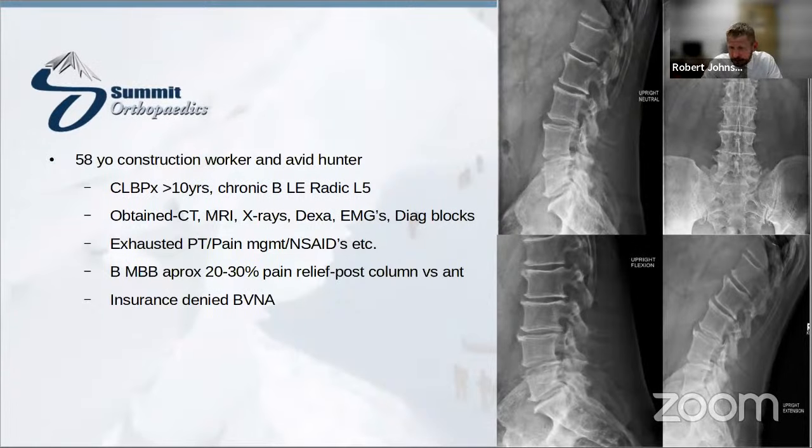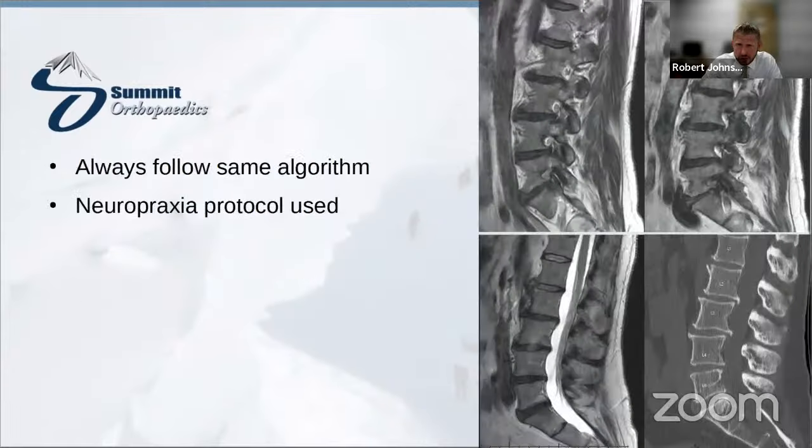As you can see from the x-rays, he's got listhesis at multiple levels, most of it's static, very little dynamic. He's got osteophytes, degenerative disc disease, disc collapse, multiple levels. But this gentleman was just absolutely adamant that he would not fuse. He didn't care what it cost, what he needed to do. He just absolutely did not want a fusion. And so we did our best to help him understand those expectations and the pros and cons and all that good stuff. And so he chose to go forward with that disc replacement.